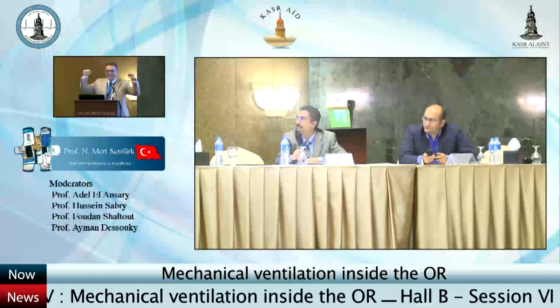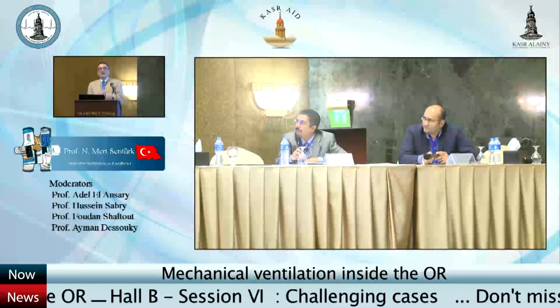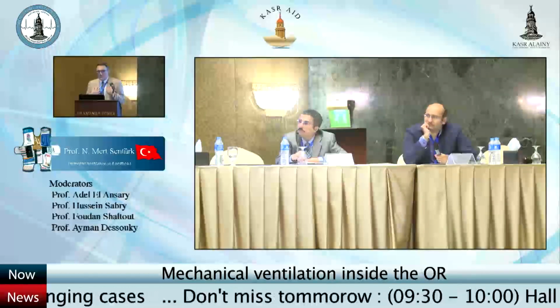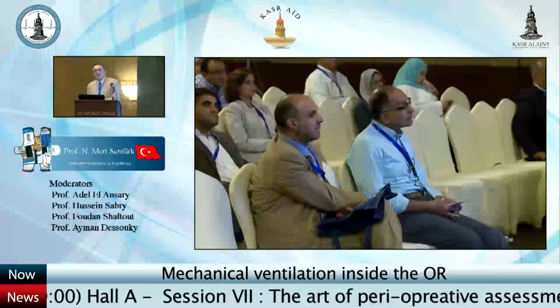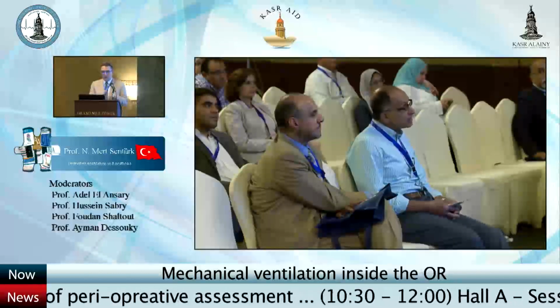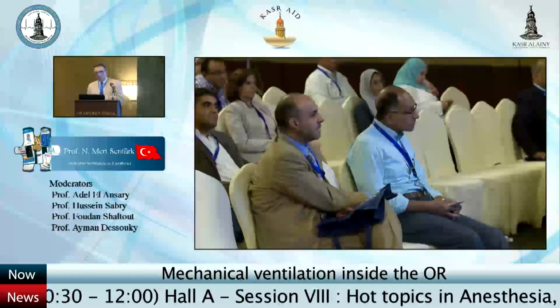Thank you for the question. That was also a slide actually, but I have skipped it. I'm a fan of the pressure controlled ventilation. This was my first international publication actually, but it has been shown afterwards that there are no concrete differences between pressure controlled and volume controlled ventilation. I still use pressure controlled ventilation.